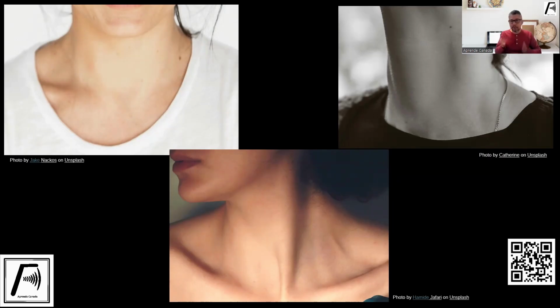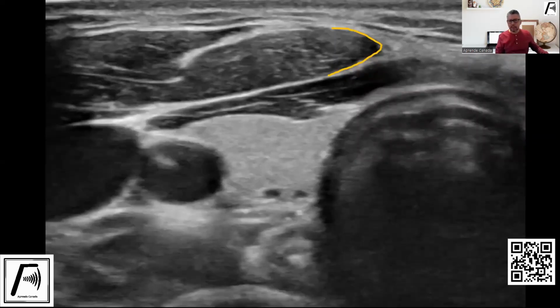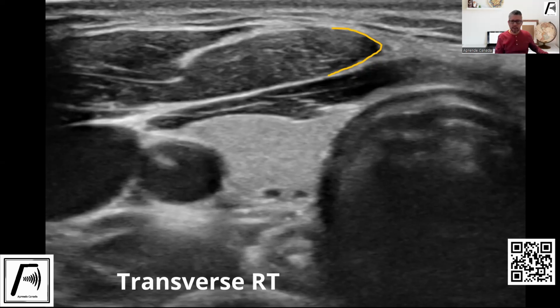Sometimes it's a combination of both, asking the patient to turn the head and us moving the transducer more medially or more laterally. And so here's an example of how you can get rid of it, in that we have moved the shadow from the thyroid lobe, and now you can see that the edge of the muscle is on the trachea, right? And so obviously that's not going to affect us, right? So give it a try.